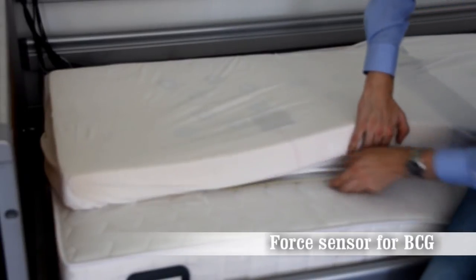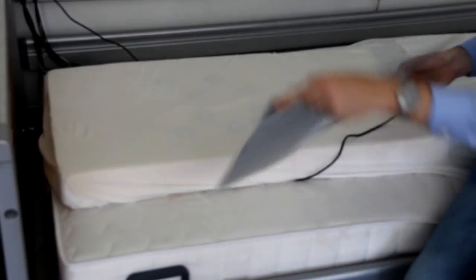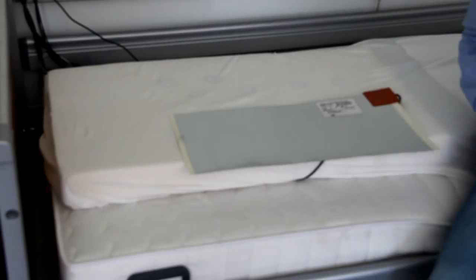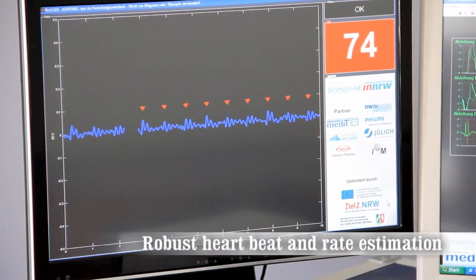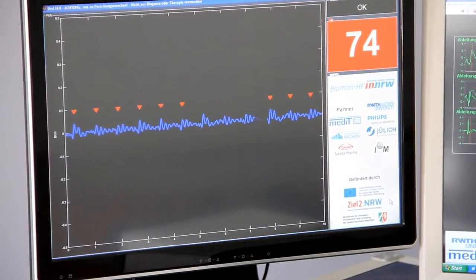In this prototype, the BCG is measured by this thin film sensor which can be placed underneath the mattress and which registers even the tiny vibrations caused by the circulation of blood. Sophisticated signal processing methods enable the robust and reliable extraction of heart rates from these vibration signals.